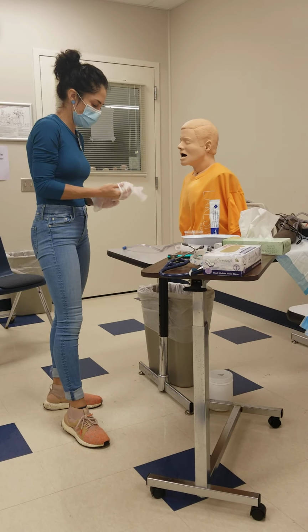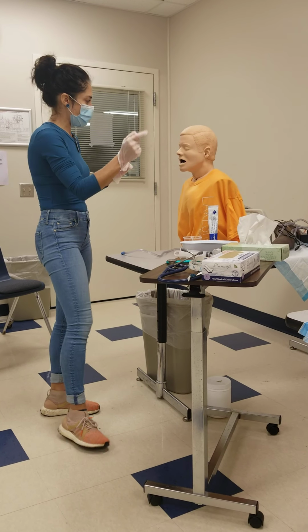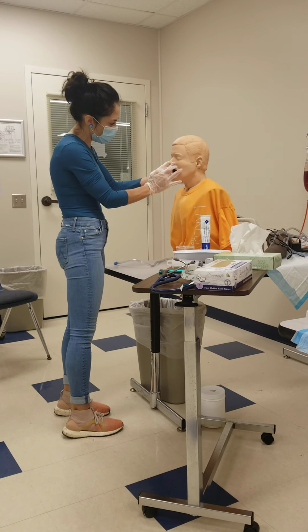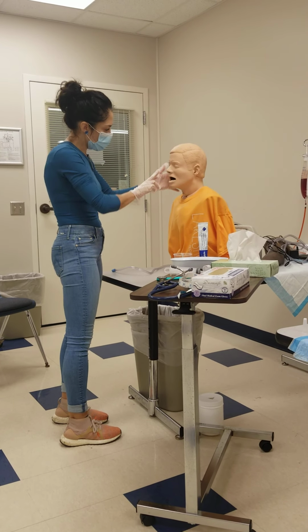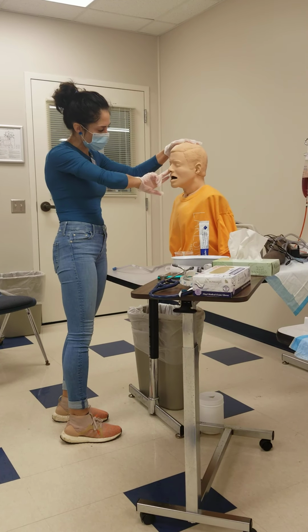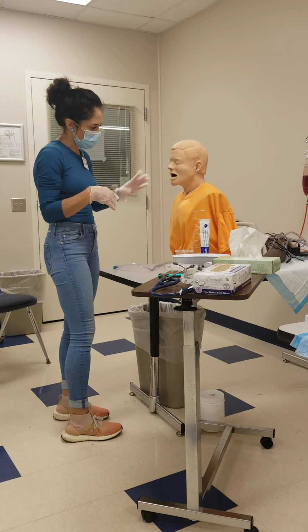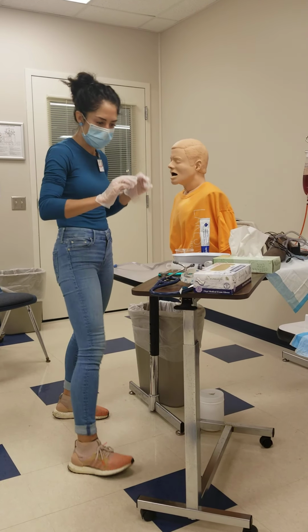And how we will do that is by pressing against one nostril. I'm going to have you breathe in and out of the other. Okay, and then now we'll be doing the same to the other. All right, which one did you feel like you breathed out of easier? Your left? Okay, great, cool.